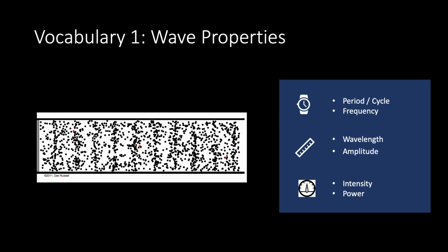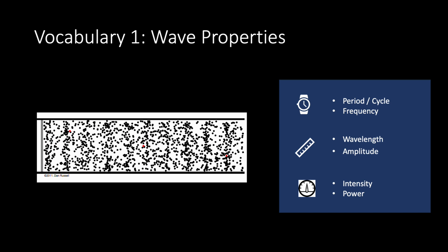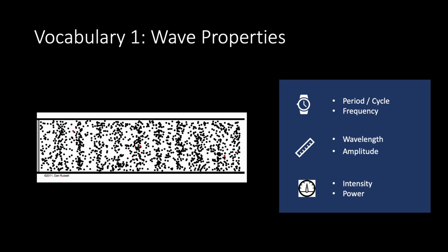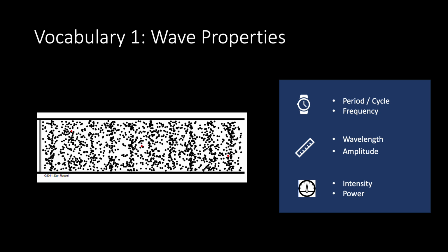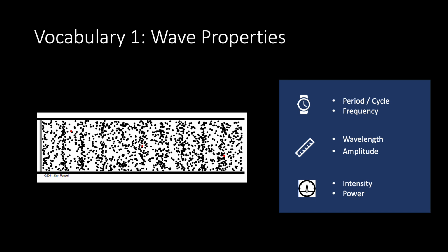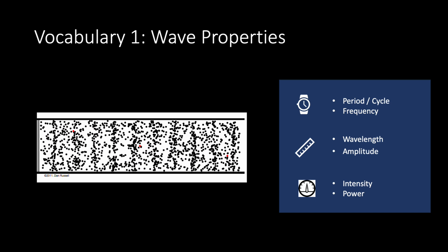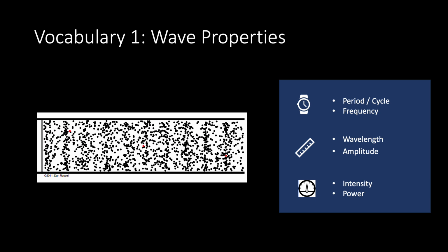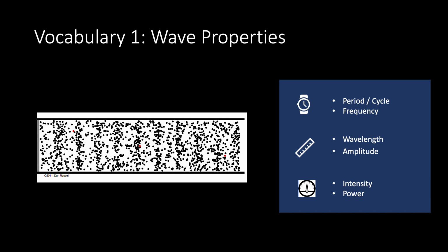And so we can understand how as this wave travels through a tissue, it's creating periods of pressure, periods of energy that it's being imparted. And we can see that represented here as the areas of pressure or areas of density that are created as the sound wave travels, as opposed to the lighter or less dense areas of rarefaction that occur.